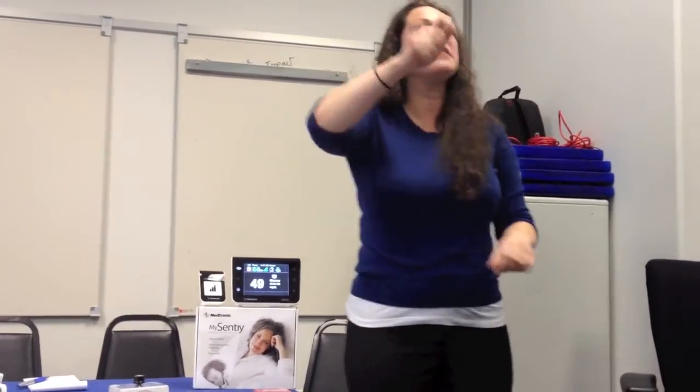We have to turn them up slowly because what we're using here is a simulator, and so it'll move a little bit slower, and it is transmitted every 5 to 7 minutes. So he'll move up slowly, and I promise I'll get him back up. Get it so high so you can hear the high alarm later.